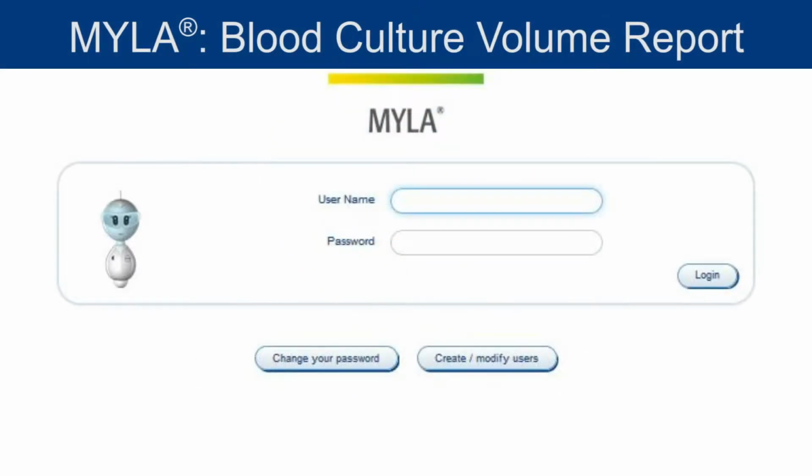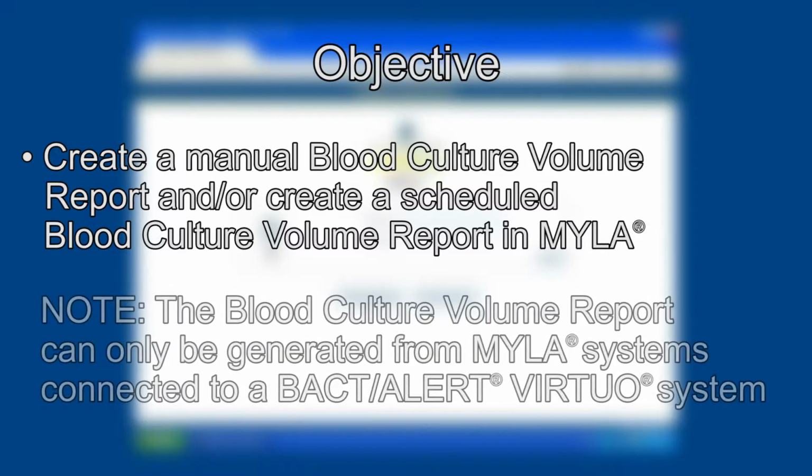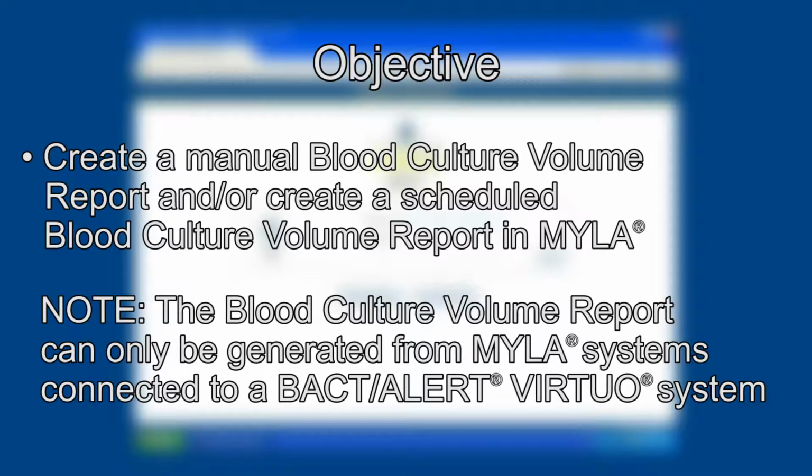The purpose of this video is to provide guidance for creating a blood culture volume report using the MYLA software. At the end of this video, you should be able to create a manual blood culture volume report and/or create a scheduled blood culture volume report in MYLA. Note, the blood culture volume report can only be generated from MYLA systems connected to a BACT Alert VIRTUO system.